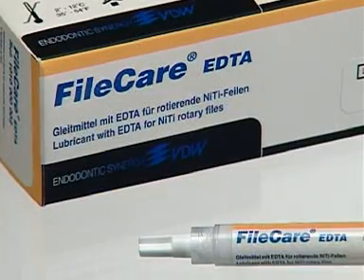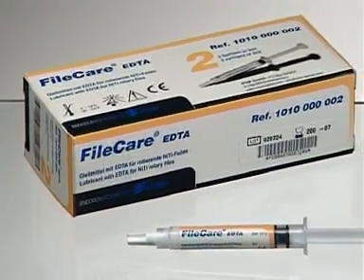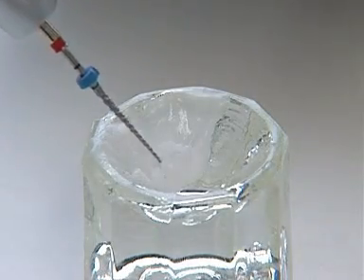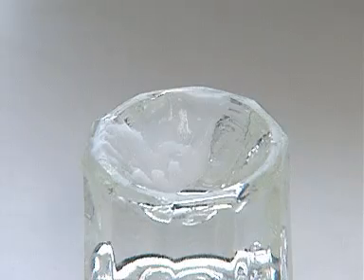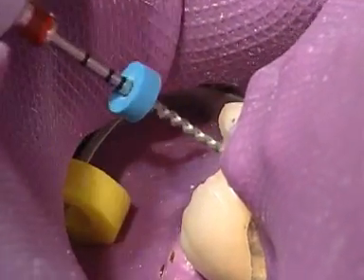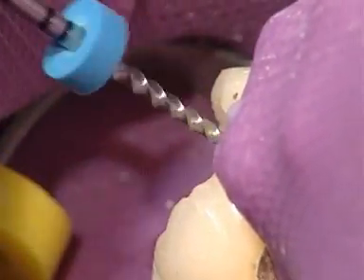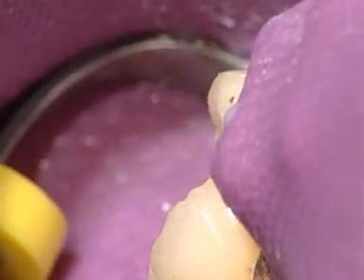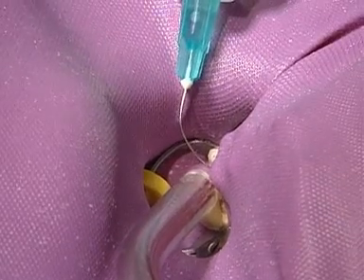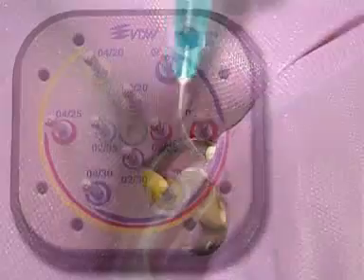An important aid in root canal preparation is a chelator containing EDTA, such as File Care EDTA, to remove smear layer and open dentinal tubuli. The file is coated with some File Care EDTA before being inserted into the canal. The file is inserted into the canal and applied with slight pumping movements for 5 to 10 seconds. EndoIT Professional monitors the optimal torque and speed for each file. This maximizes efficiency.